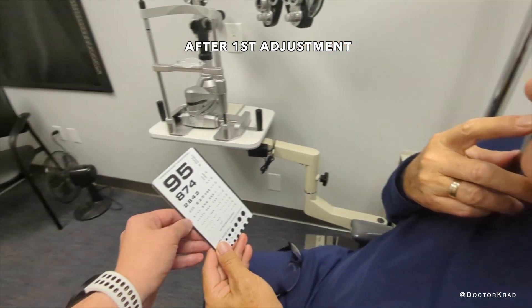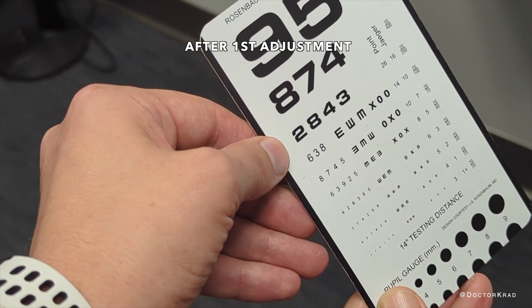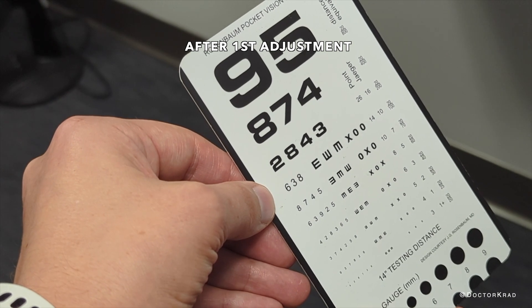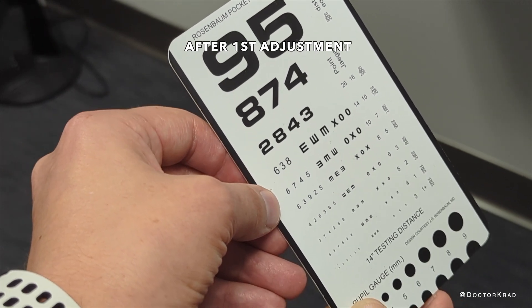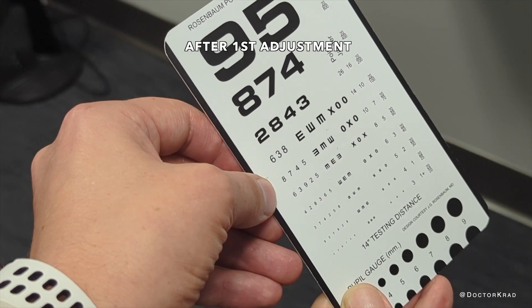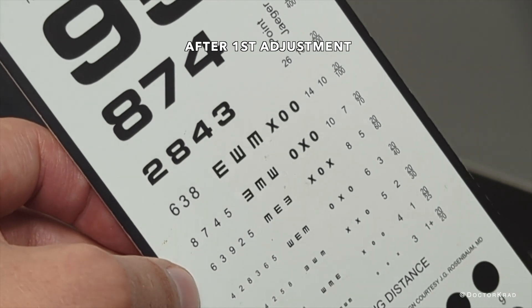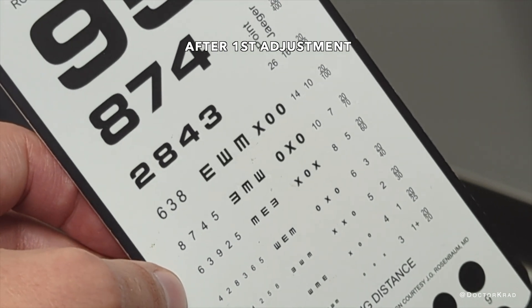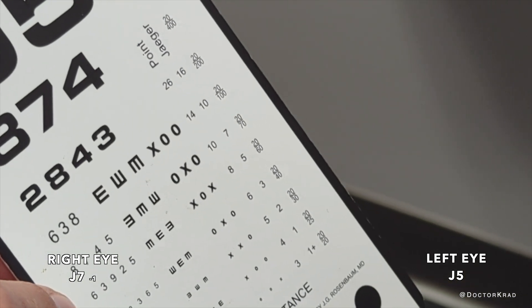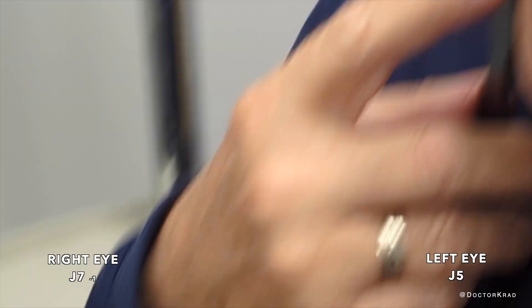We're going to try this left eye. Try this one: 2-8-4-3. Try this one: 6-3-8. How about here? 8-7-4-5. And try here: 6-3-9-5, maybe. So you're about J5 right now with the left eye.